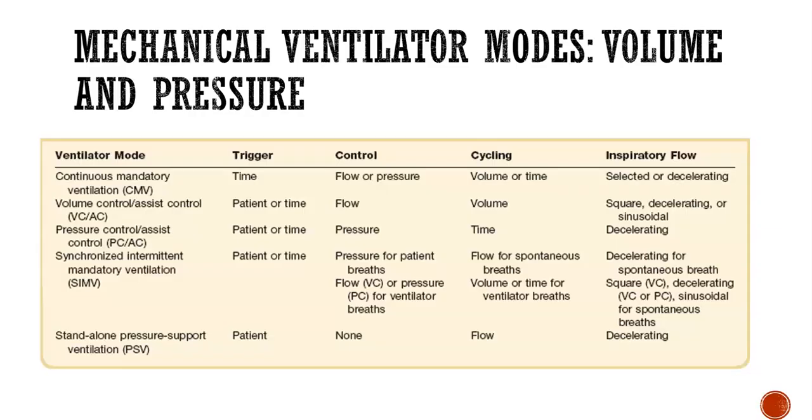The main advantage to this mode is safety, and it decreases the chances of barotrauma. It's a more careful monitoring process because as lung compliance improves or doesn't improve, volumes will change and so will the overall benefits.